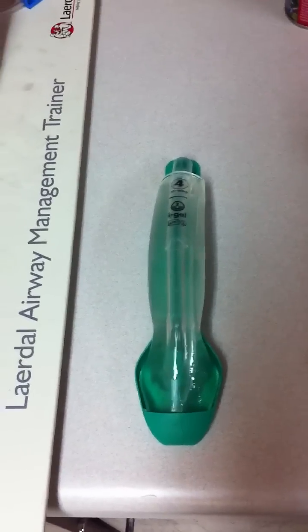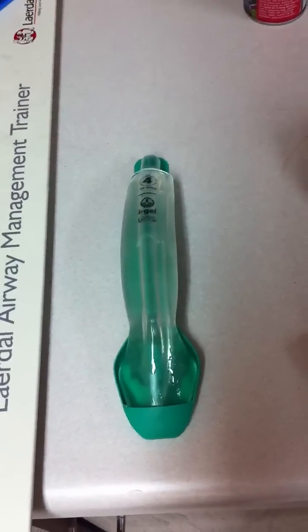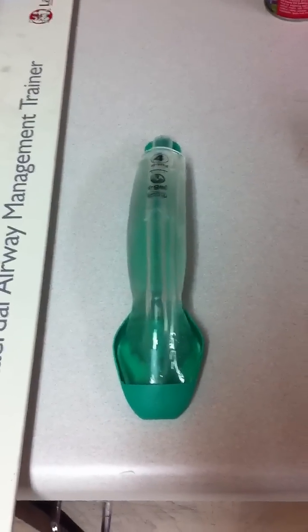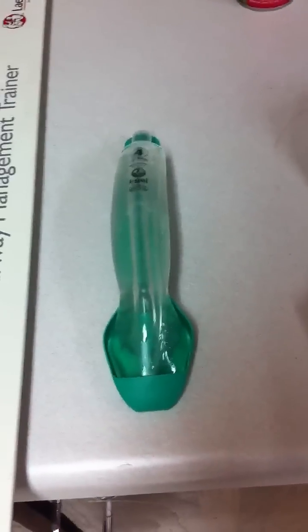Good day everyone, this is Chris with the Ancient Scholar. Today I'd like to introduce you to one of the newer devices that have appeared on the market — at least in the United States. This has been out in Europe for a couple of years. This is a new type of what's known as a supraglottic airway device.